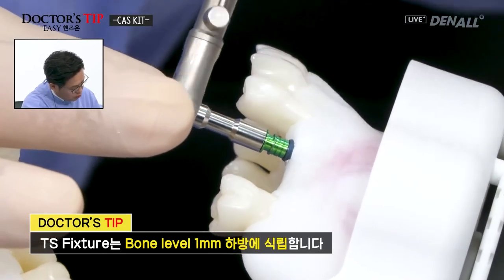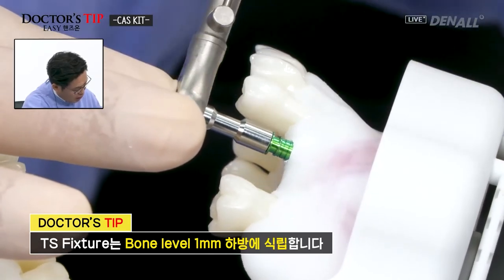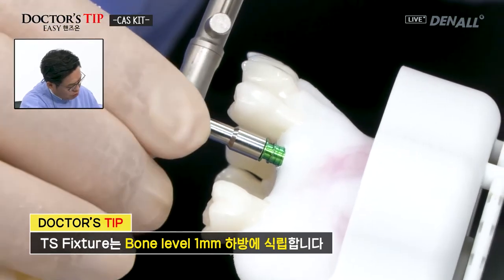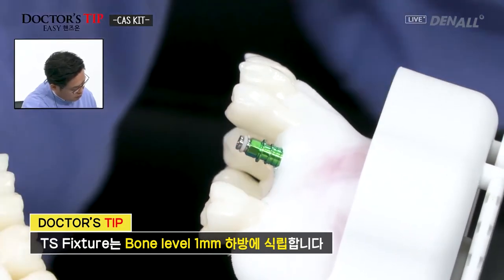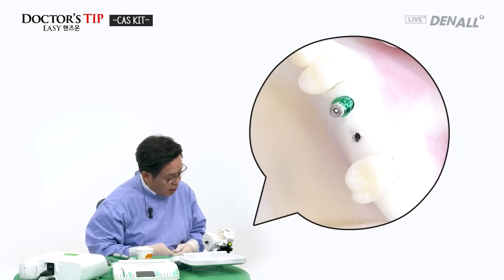30 newton centimeters, enough torque has been achieved on the model. This is the TS fixture, and it will be placed up to 1 millimeter below the bottom of the bone level. Two implants will be placed.